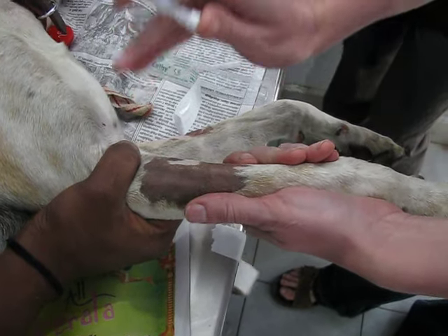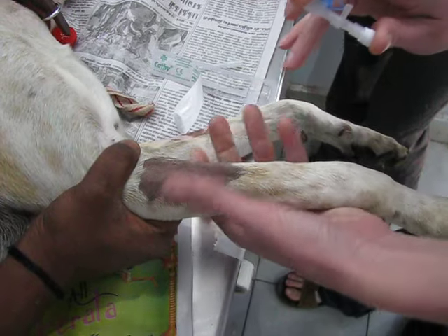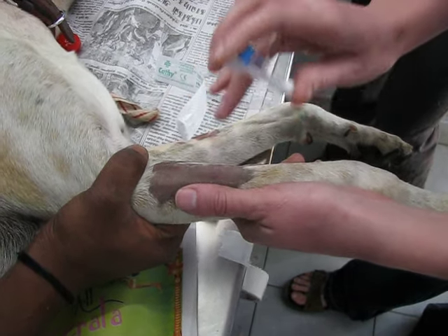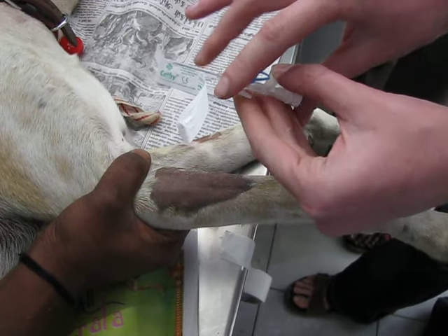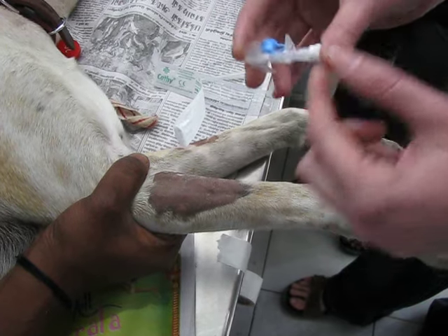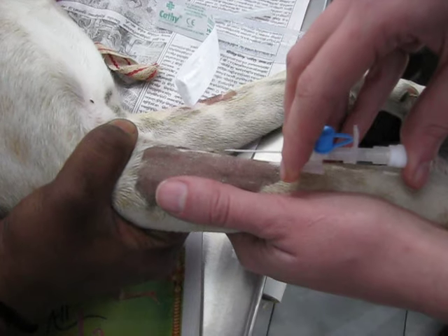I always prefer to start with an assistant raising the vein, just like Gongal is doing now, so that I can hold the leg with one hand and the IV catheter with the other. For catheters with wings, I place my index finger and middle finger on the wings and my thumb on the white cord. And we feel the vein nicely.